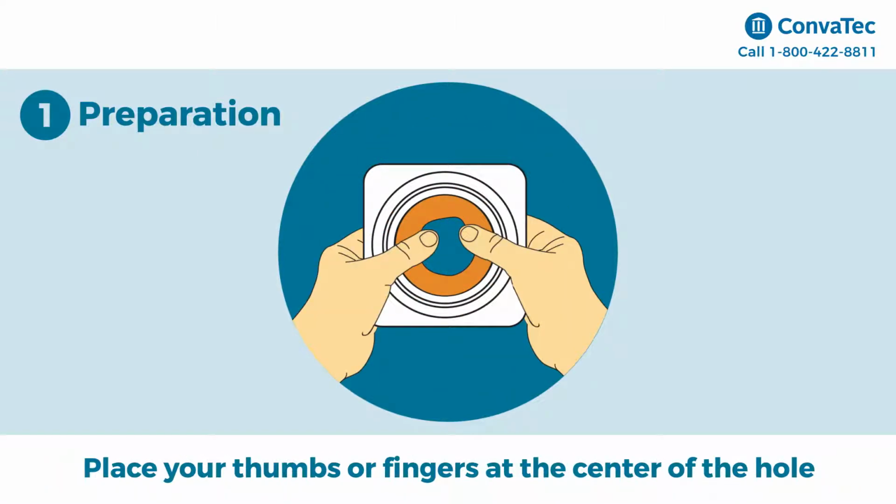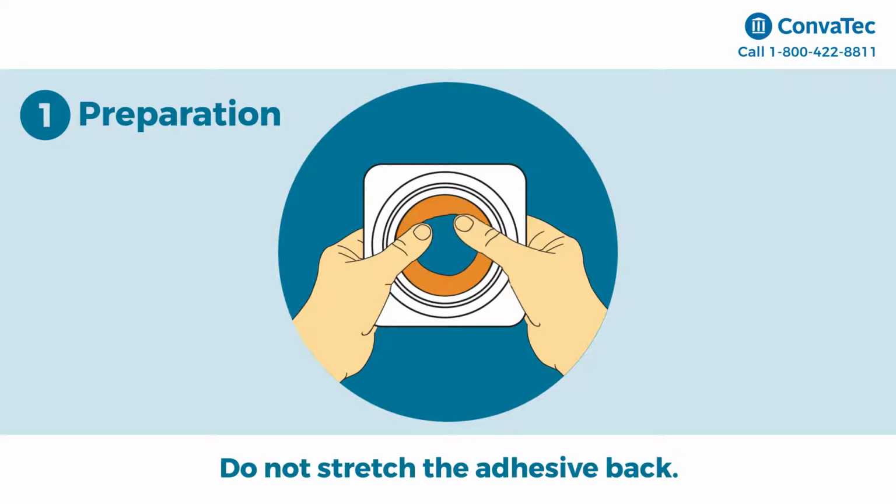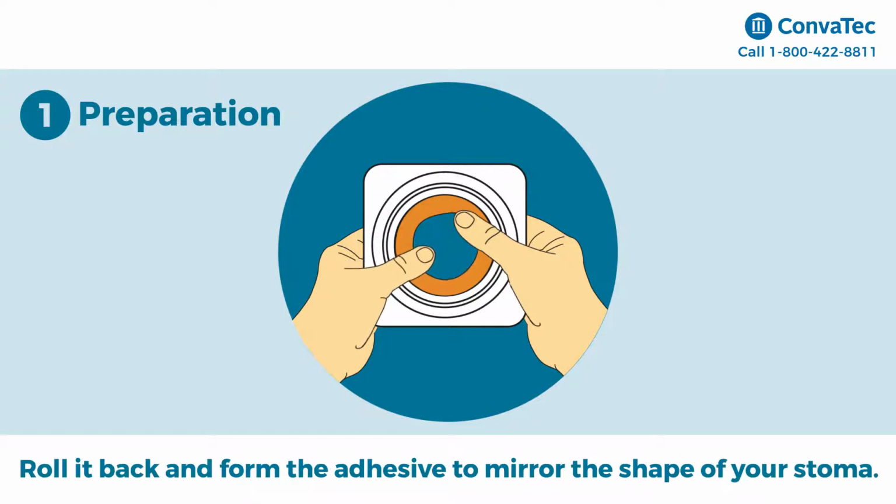To personalize the stoma opening, place your thumbs or fingers at the center of the starter hole and begin to roll the adhesive back. Do not stretch the adhesive back. Roll it back and form the adhesive to mirror the shape of your stoma.